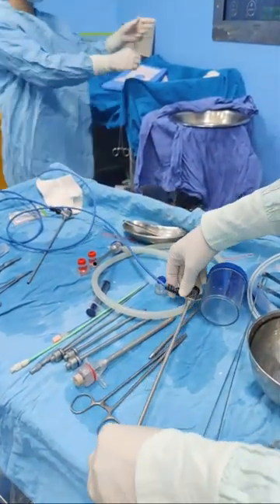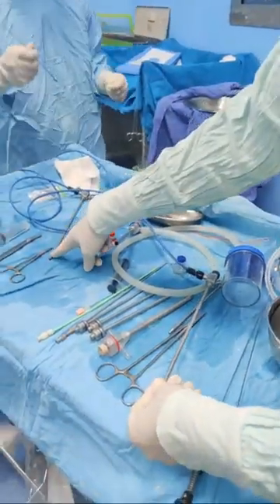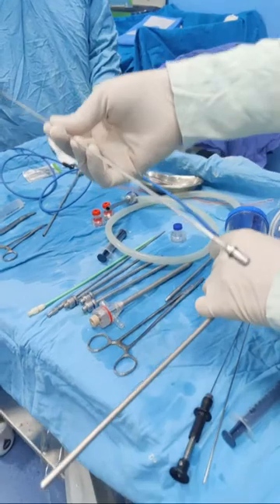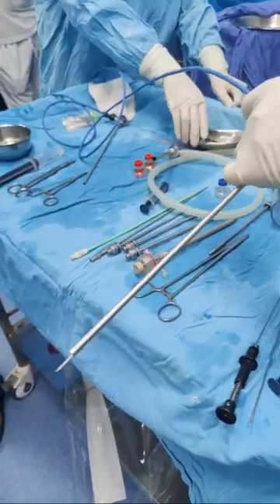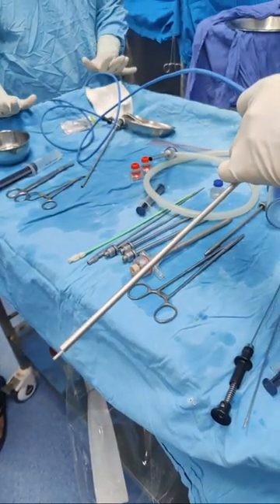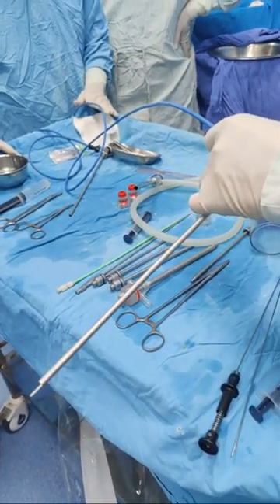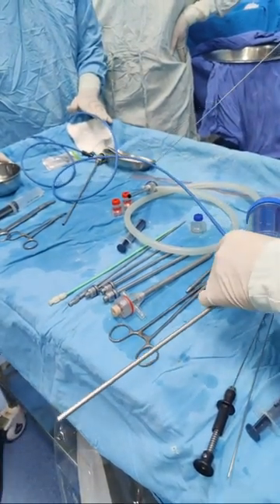So this is a nephroscope, this is 16 French, this is 13.5 French, and another nephroscope which is 19 French, it is a 9 French. See, this is a thick probe, and again it goes very easily inside and it breaks. Because there is a separate instrument channel, the lateral vibration of the pneumatic probe will not occur, and very good force is transmitted to the stone to break the stone. Okay, the rest of the thing is the same.